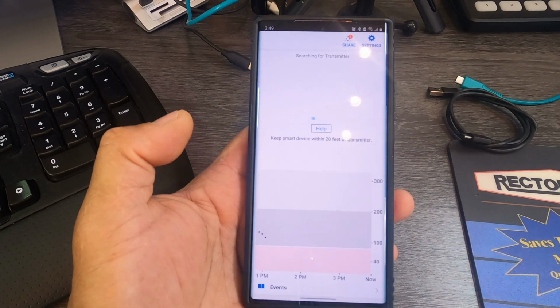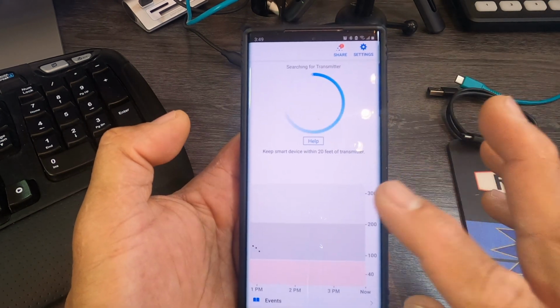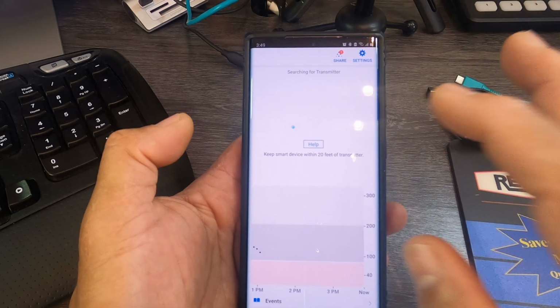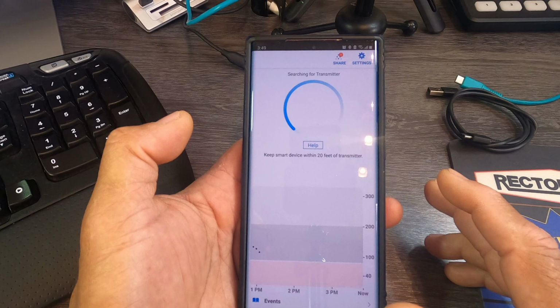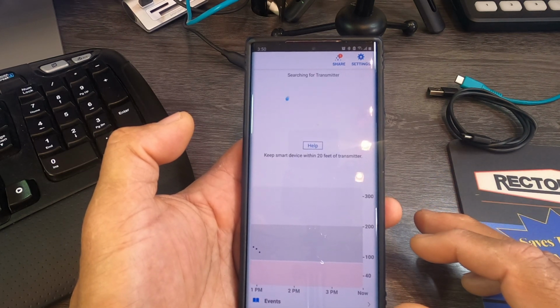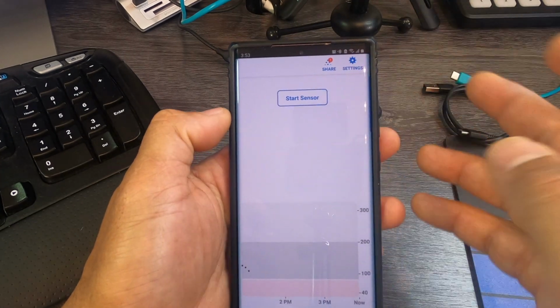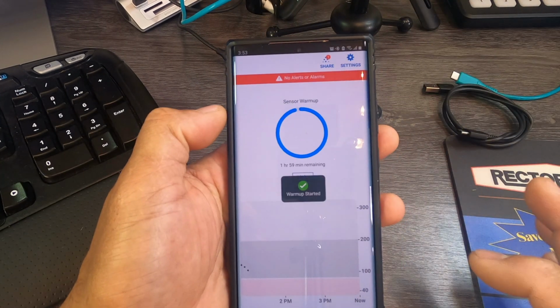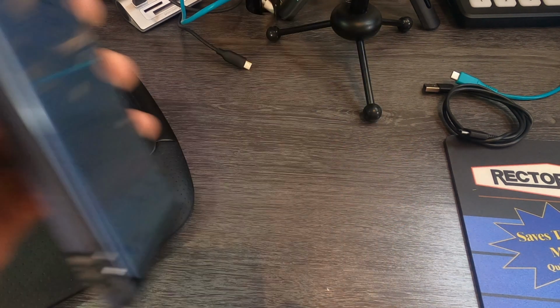And now you're going to see this. This is very important. You want to make sure that it's looking for it. It might take a few minutes to get it on there, guys. But you want to make sure that you get this and just let it do its stuff, and then it will get into the mode where it's going to appear. Make sure you keep it close and we're good to go. So I just got a message saying that it's good to go. So we start the sensor, warm up time will start up, and here we go.